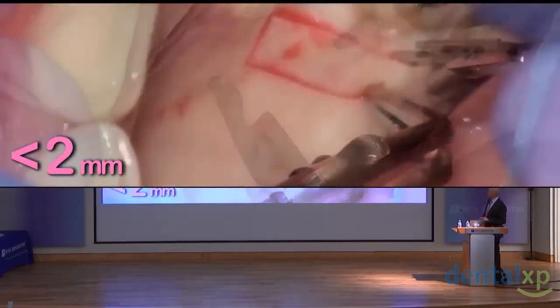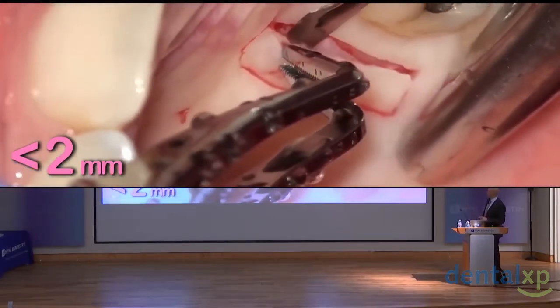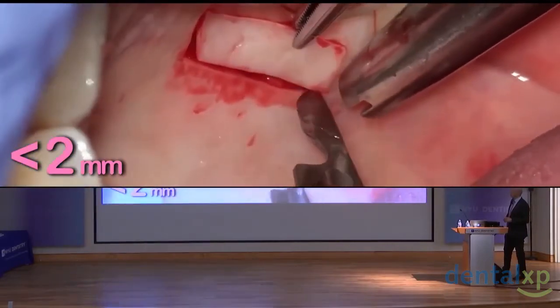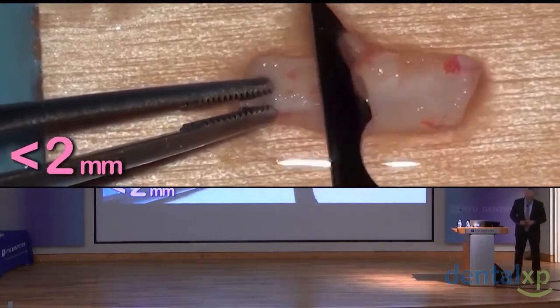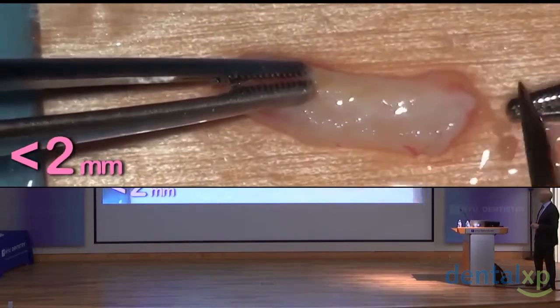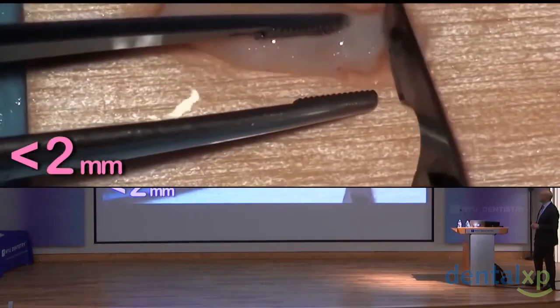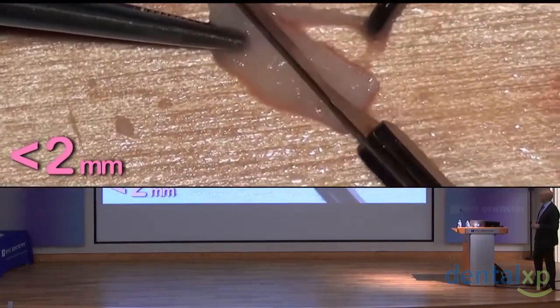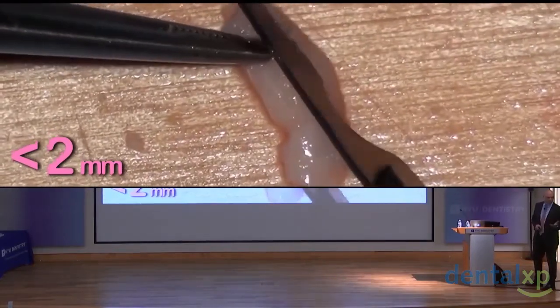You see the video, cut it off. I leave the periosteum in place, and in that way, it doesn't hurt at all. After that, of course, I take out the epithelium, and also the fat, if I have fat in the graft. But it's a technique I use around 5% of the cases, not more. I think it's not necessary to use it in every case.